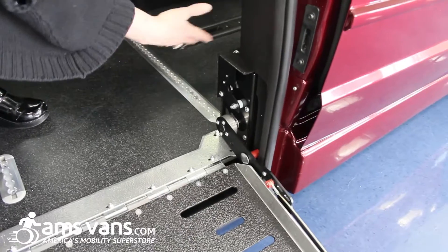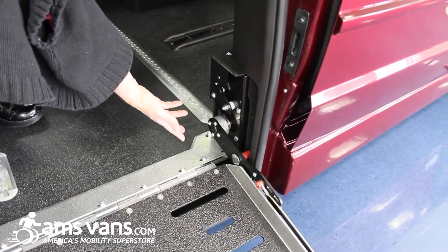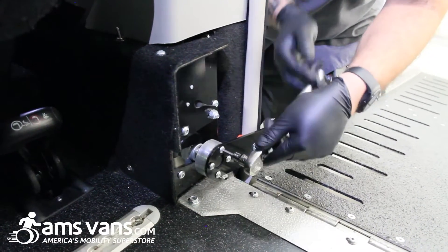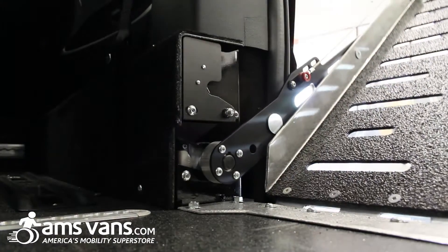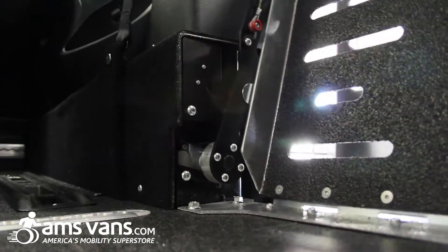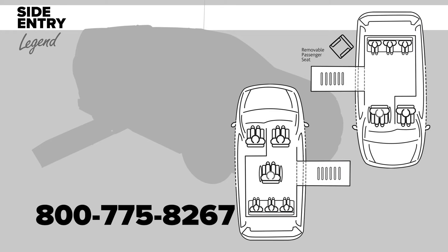The van power ramp motor is right here. This can be repaired by any mechanic anywhere in the country. It's separate from the original operating system of the van and it's very easy and very simple to work with. This is the AMS Legend side entry conversion.